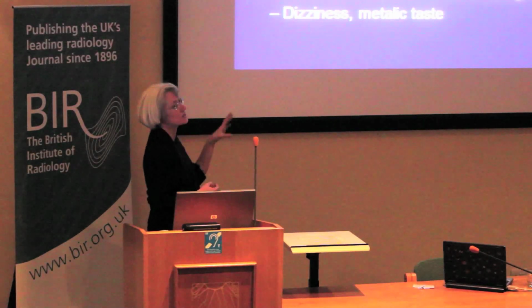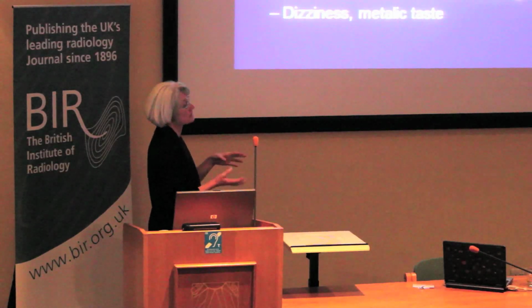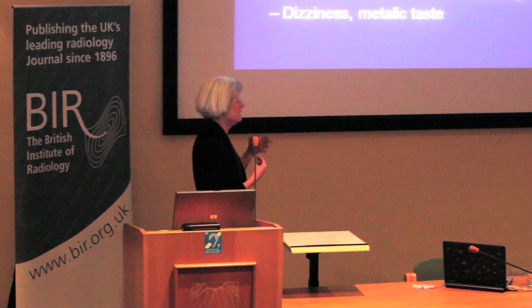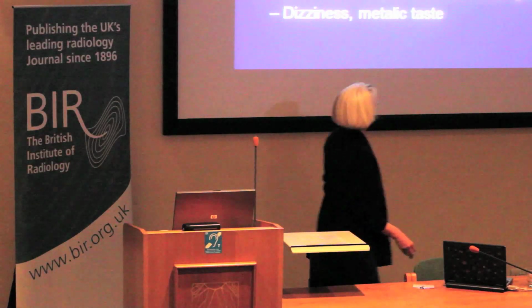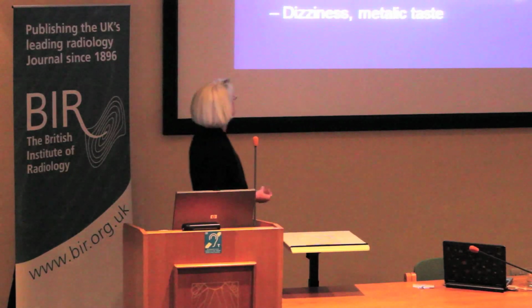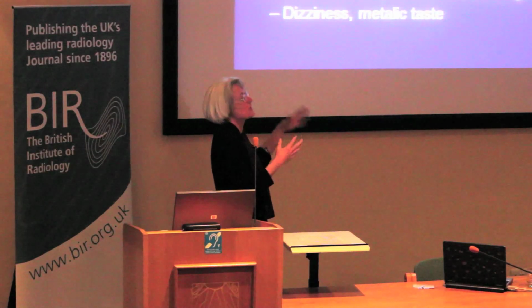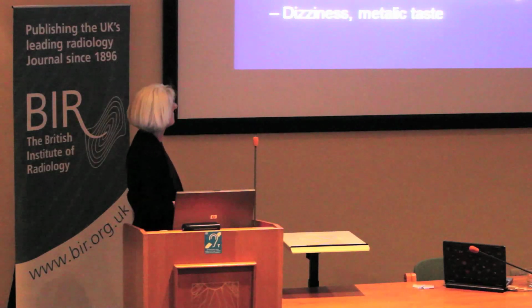However, there are some indications that it's a kind of co-mutagenesis effect with other carcinogens. There are some effects of X-rays seeming to be exacerbated by magnetic fields. This isn't really a problem for MR, because apart from possibly PET MR, we try not to expose people to X-rays and MR simultaneously. But there is a potential area there. And I think it's important to know there are potential areas, because it puts us out of this realm of MR being safe. You can actually put some boundaries as to safety. I think it makes it easier to talk about.